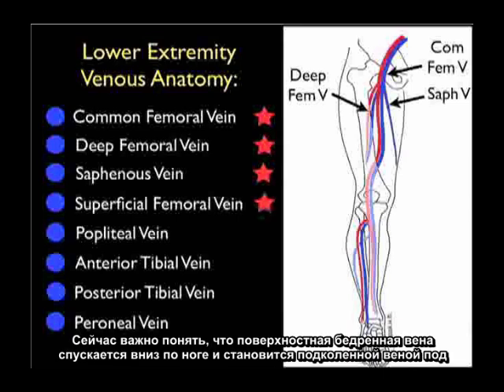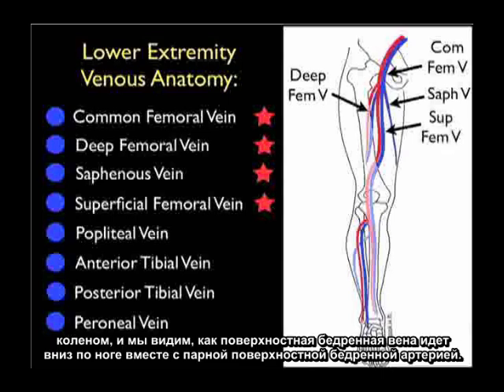It's important to realize that the superficial femoral vein is the vein that actually continues down the leg to become the popliteal vein behind the knee. We note the superficial femoral vein coursing down the leg, accompanied by the paired superficial femoral artery.